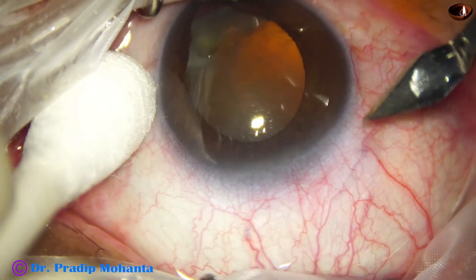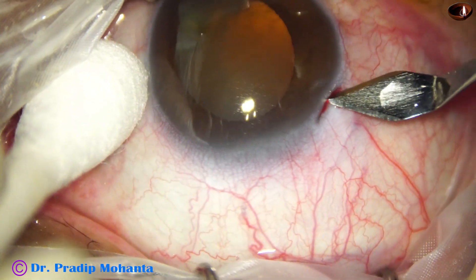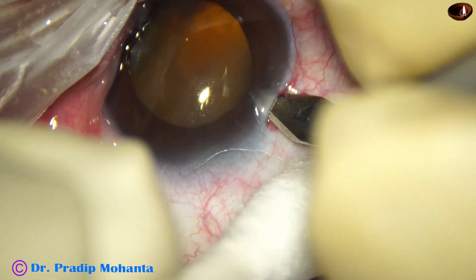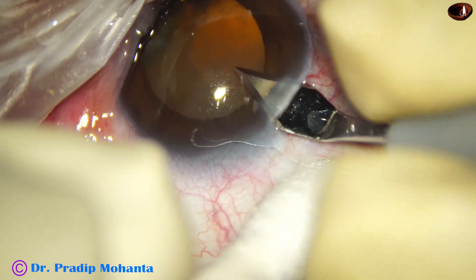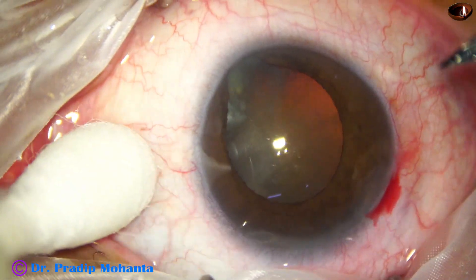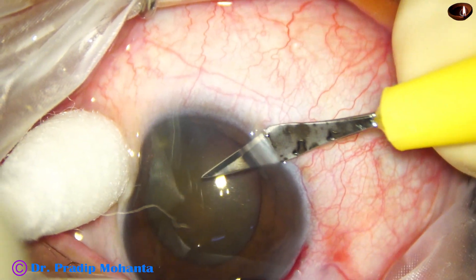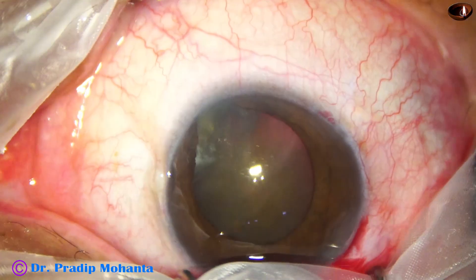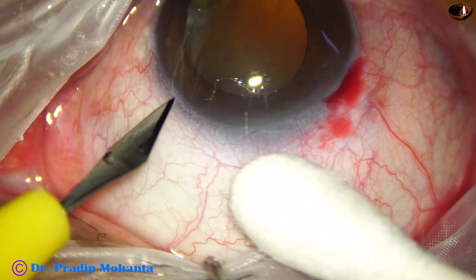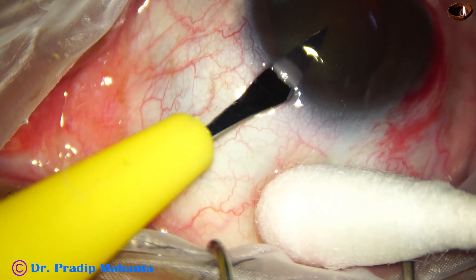The main incision is triplanar. It is being made with the help of a 2.8 mm steel keratome. The ocular surface is supported by a cotton-tipped applicator and no toothed forceps is used. This is a side port on the right side of the main incision, 3 clock hours away. Another side port on the left side of the main incision, almost the same distance away.